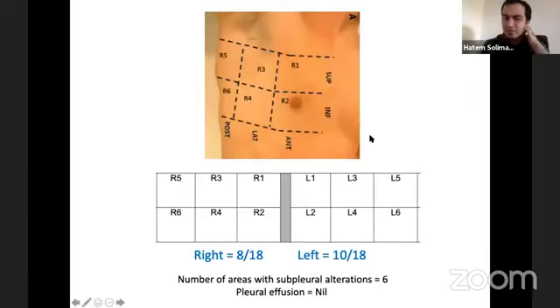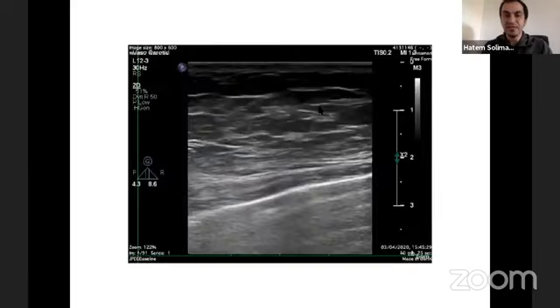And we also have the lung aeration score, which is one of the scores proposed to get an idea of the degree of aeration. You can do the scoring on a daily basis, or more or less often if you think it is useful. It's a tool that could enable you to monitor the progression of aeration in these patients. And when I do that, I see the progression of the scoring and the reduction of the score, which reflects an improvement in the aeration of the lungs.